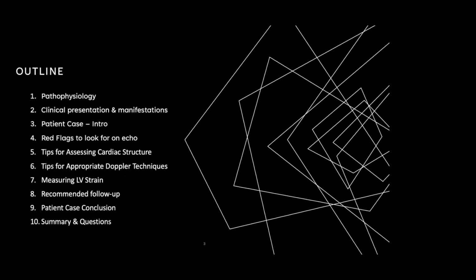This is today's outline. We'll start off with some pathophysiology and clinical presentations. I'll then go into a bit of a patient case we had a couple of weeks ago. And then we'll delve right into the red flags and how to really assess the different cardiac structures. We'll go through some examples of LV strain, and then I'll touch on the guideline recommendations for following up these patients with non-invasive imaging.